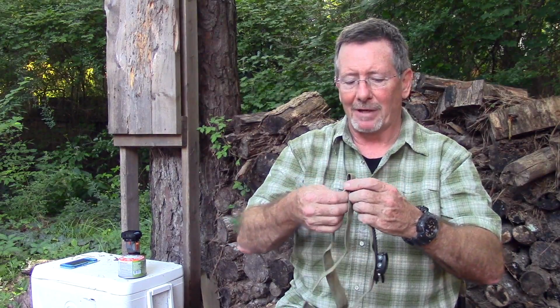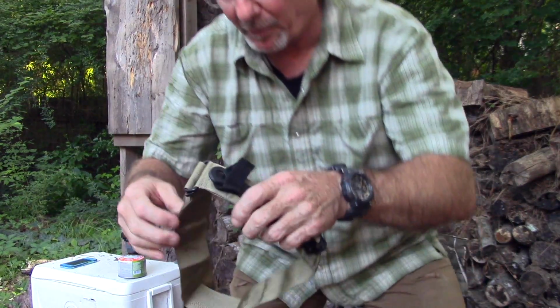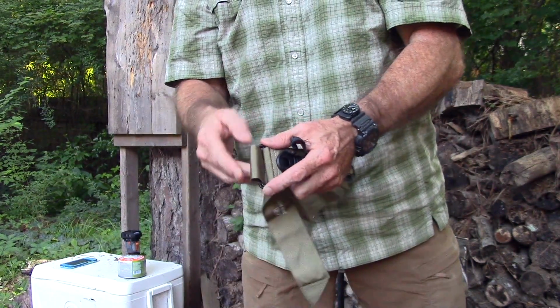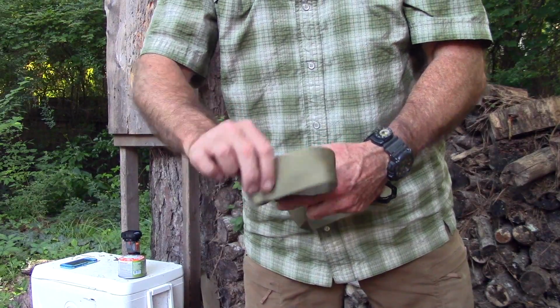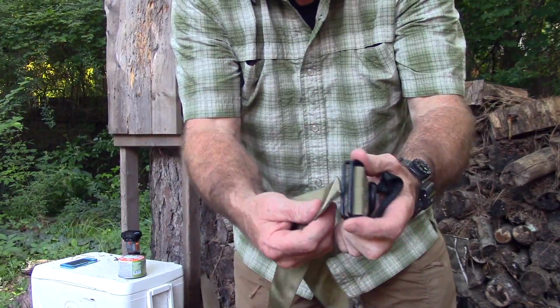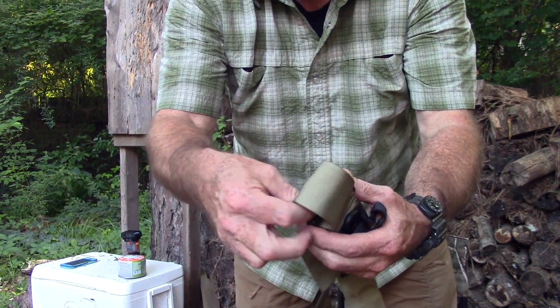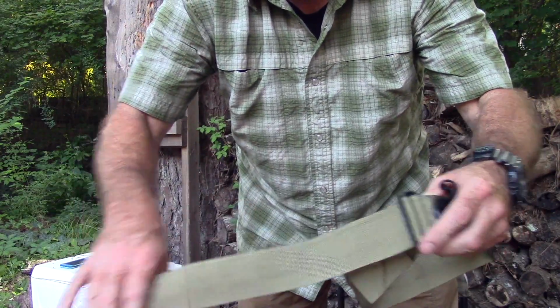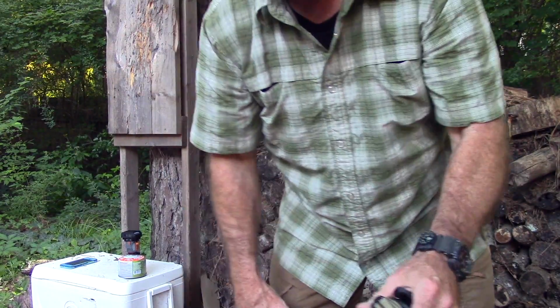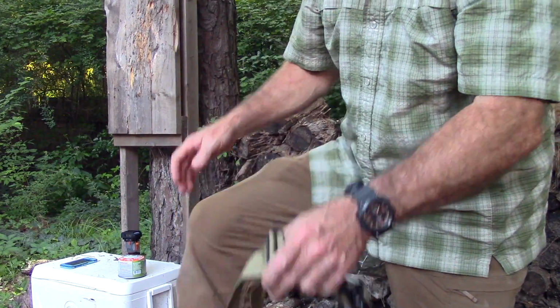So here's the way they recommend putting the TX2 on by yourself. I'm going to demonstrate on my arm because I think that's more difficult. Just to show you, if you put it on your leg, you've got two ways you can do this. You can unthread it through the buckle like so, and basically thread it back in. It's just a standard 2-ring buckle, through the outer one there, to tighten it, and then you pull it tight. If you can't slip it around somebody's leg or your leg, you can take it off and do that. That's going to take time, but I'm just going to show you.